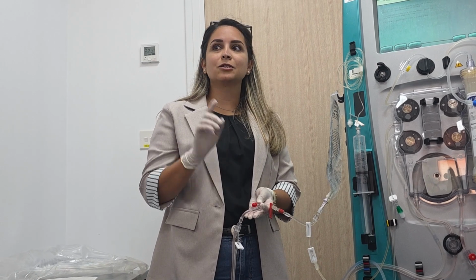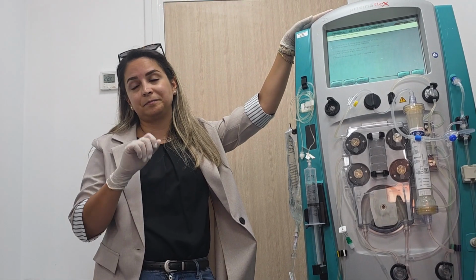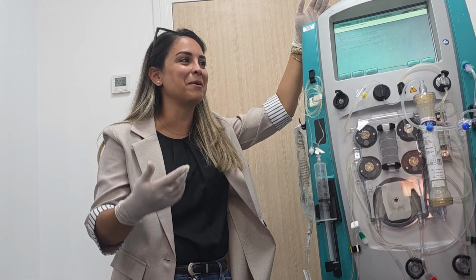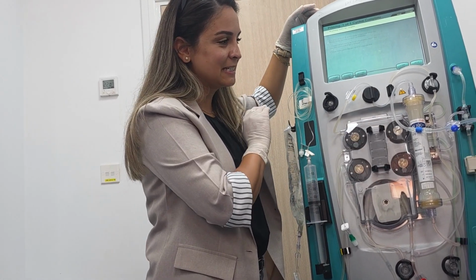Resultant. We will try. So try from your side. Like this, no? When you have the arterial line, we are even doing a stop and resume. No? To compare. He's already doing it anyway. Your own ways. I am with you. So let's see.